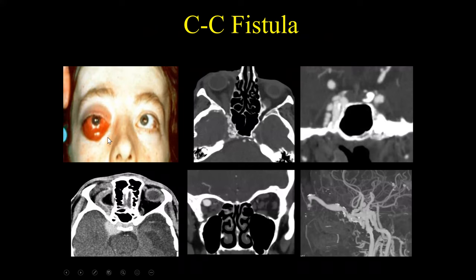Another cause of pulsatile exophthalmos is carotid-cavernous (CC) fistulas — there are two types. An indirect CC fistula involves branches of the external carotid artery extending directly into the cavernous sinus, giving multiple dilated vessels. A direct CC fistula involves direct communication between the artery and vein with arterialization of the superior ophthalmic vein. CTA demonstrates arterialization of the vein. A sagittal image demonstrates enlargement and arterialization of the superior ophthalmic vein. The right was an indirect fistula and the left a direct CC fistula.